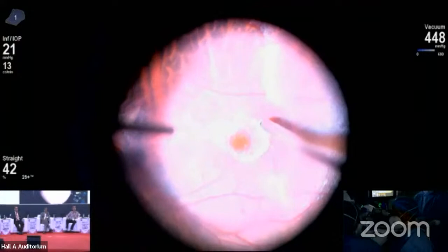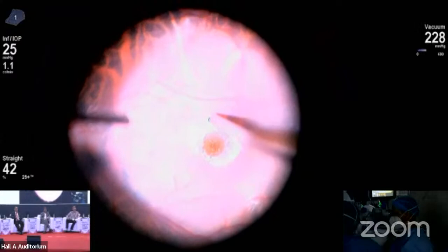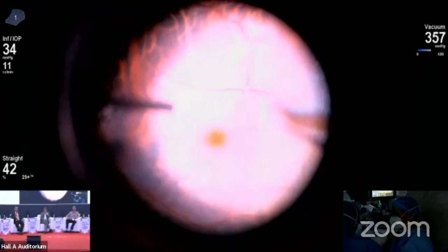And one thing is very important, as you can see here, there is a bit of an island of vitreous which is there. So this is just the area of the macula. So fovea at the center, you can see perifoveal. This can go on to contribute towards the formation of ERM in the postoperative period. So once you aspirate it, now that risk is probably gone.